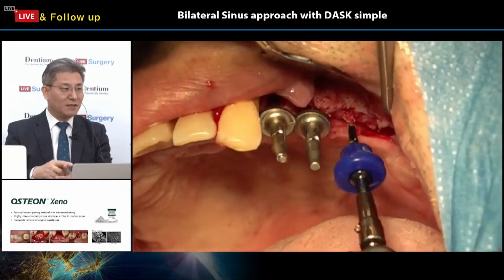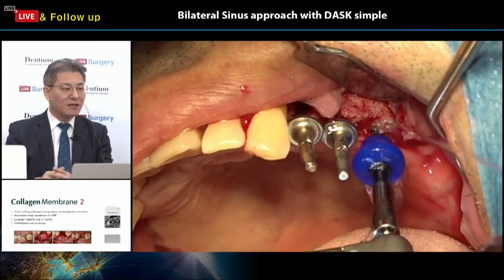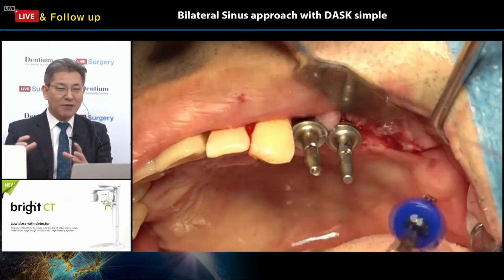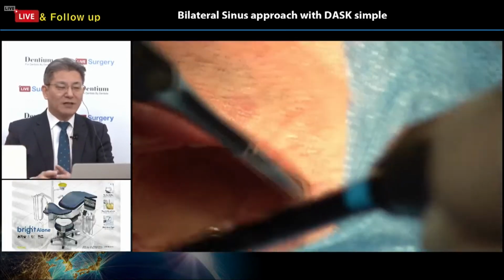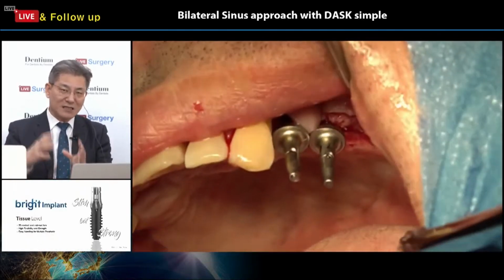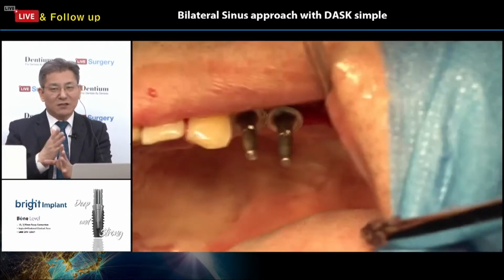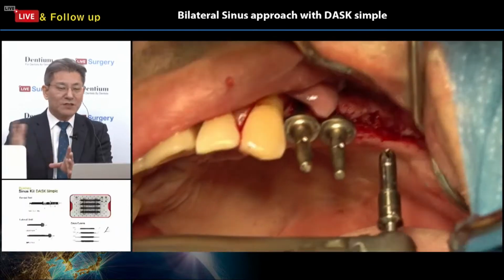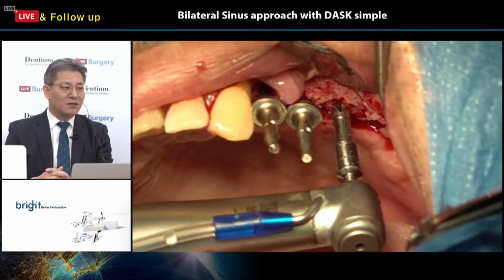At first, like this one. This one is marked 9 millimeter. Can you see the 9? 9 means 9 millimeter diameter. The diameter is 9, bigger than the previous one. The previous one is 7, this one is 9. 9 means the first molar, from mesial to distal, the mesiodistal width.